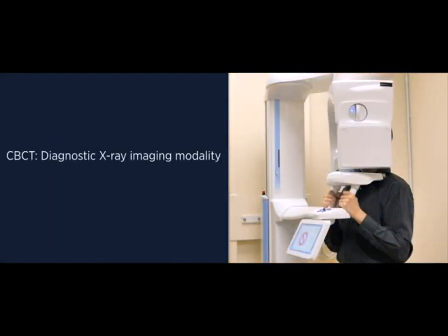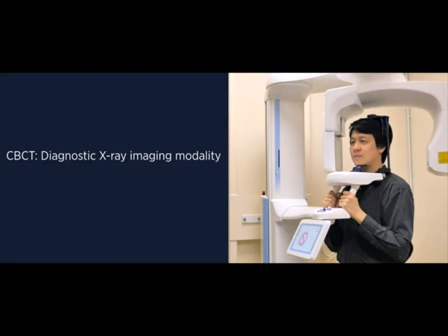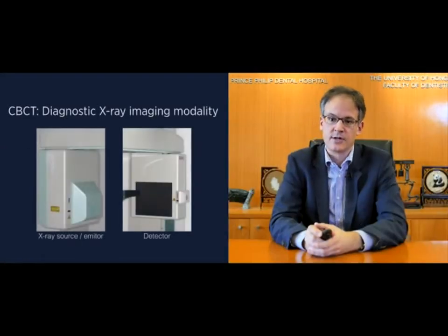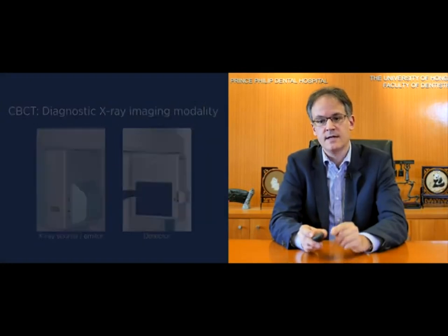Cone beam computed tomography is a quite modern and recent technology in dental medicine. It's actually about 15 to 20 years old and was introduced into our field in the year 2000. It's based on a rotating gantry which has an X-ray source on one side and a detector on the other side. You will see it on this slide here. At first look, it seems quite similar to a panoramic view, but it has other features, as you will learn now.